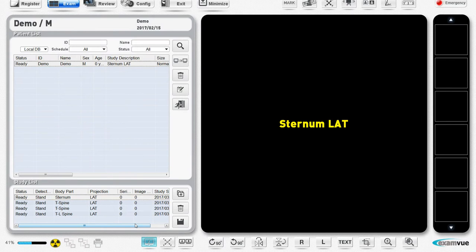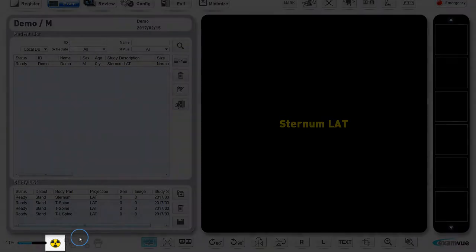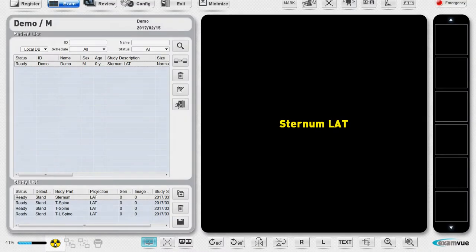At the exam window, you can check the status of the detector connection before taking an x-ray. The radiation symbol will turn yellow once there is a connection to the detector. It may take a few seconds on some detectors to connect.